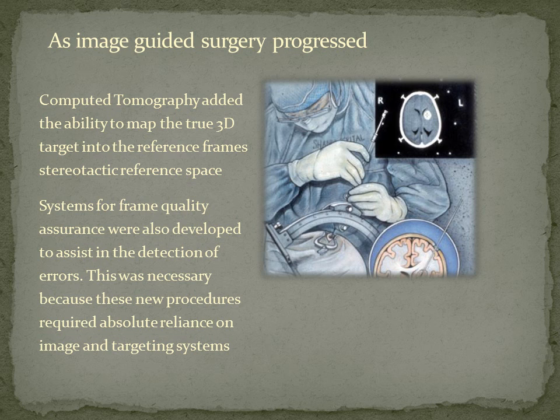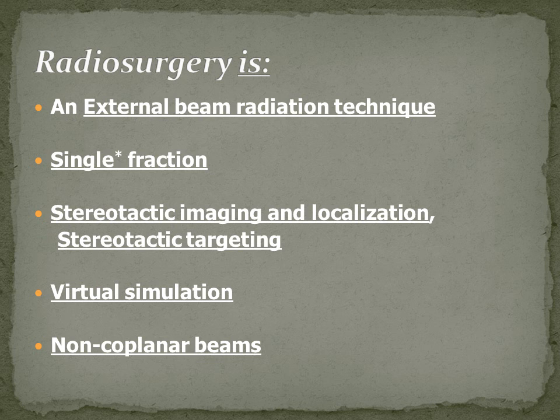Okay. When computed tomography came on the scene, things really started moving very quickly, and that's when the frames really got popular. And this is an early picture that was drawn actually here of one of the early systems, a BRW system, which was not an arc-centered system, but one of the early stereotactic systems that was used at the University of Florida. And the ability of CT scanning gave us the first true 3D databases. So we could actually, in the 3D database, okay.